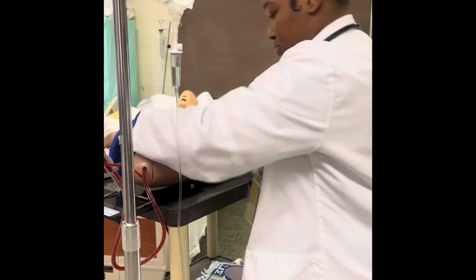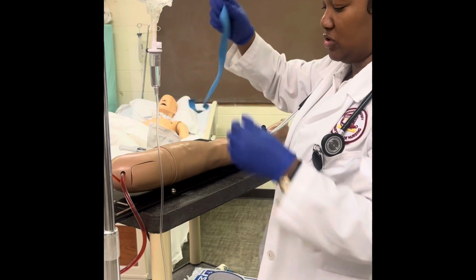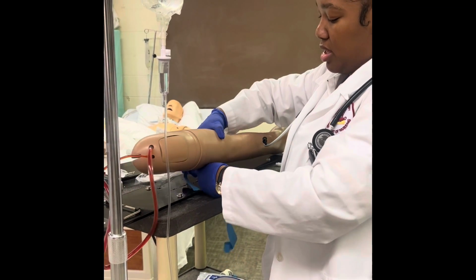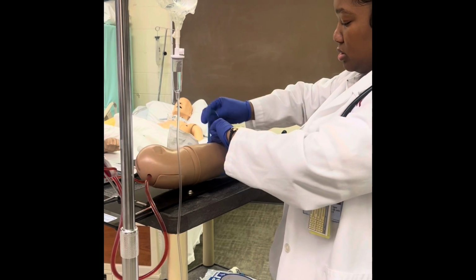Okay, now I'm going to apply my tourniquet. It's going to be a little tight, but I'll try to go as quick as possible. And as I tie, I'm gonna use a quick release knot.